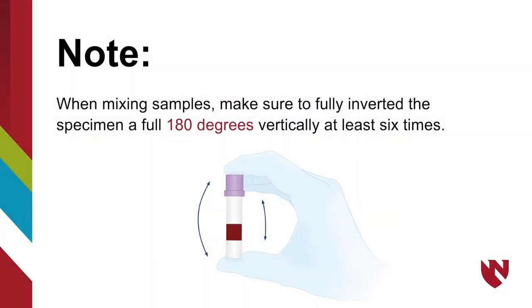Mix the whole blood control vial by tilting, not shaking, approximately six times. When the sample has been well mixed, remove the cap with the vial facing away from you.